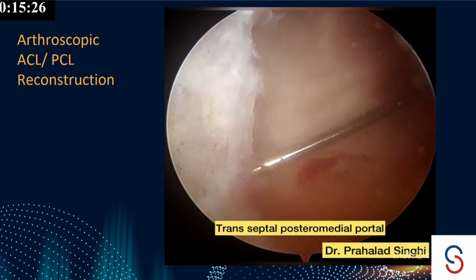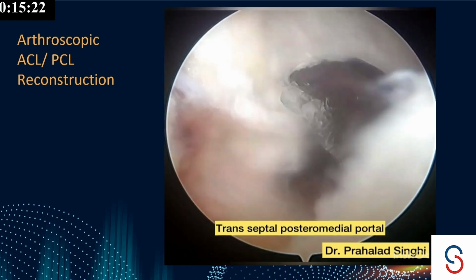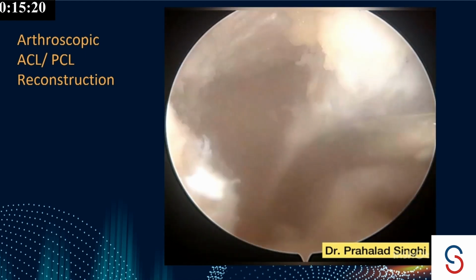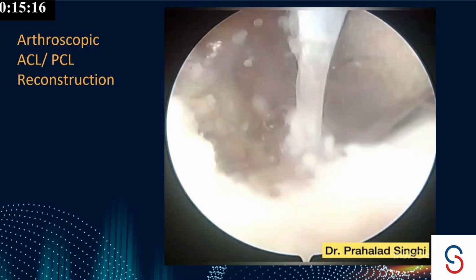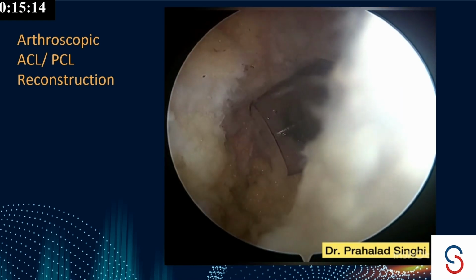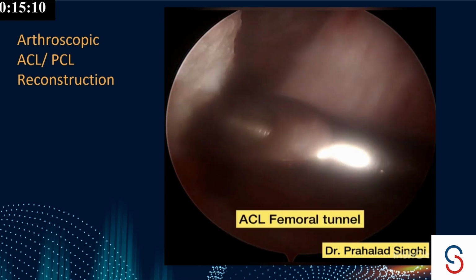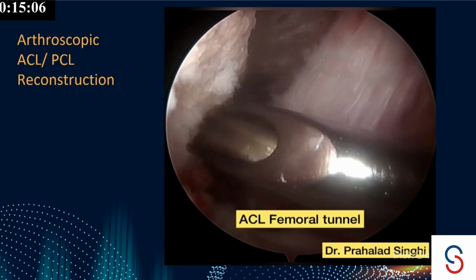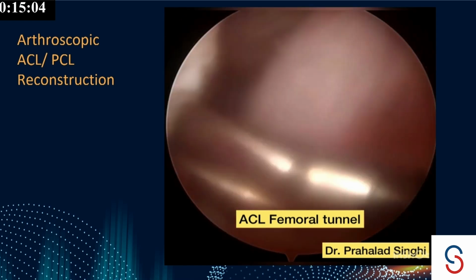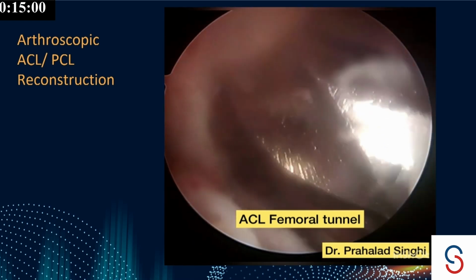We did a preparation for all the PCL tunnels here, and I usually do the femoral tunnels first and then the tibial. So I did my femoral ACL anatomical tunnel, and then we did a PCL tunnel for the femur.